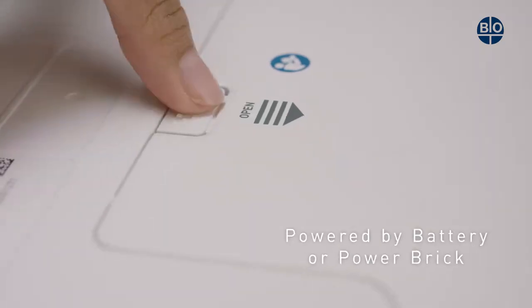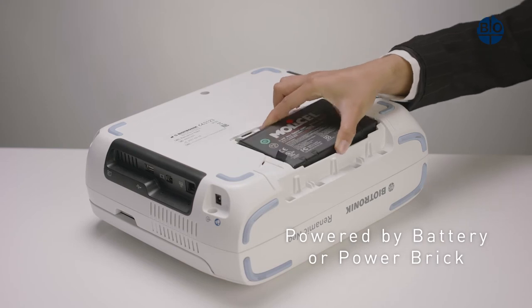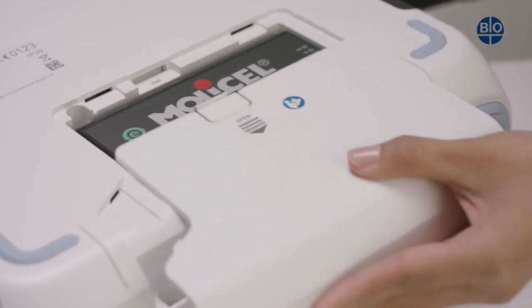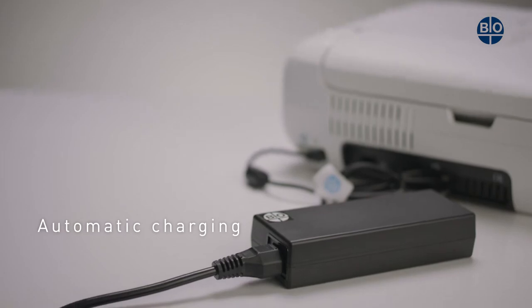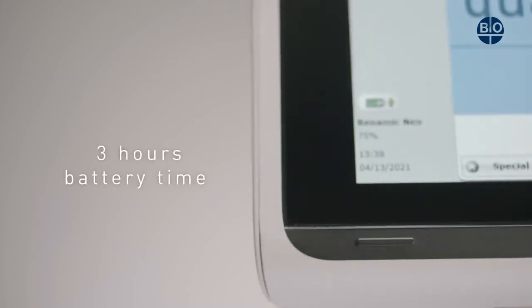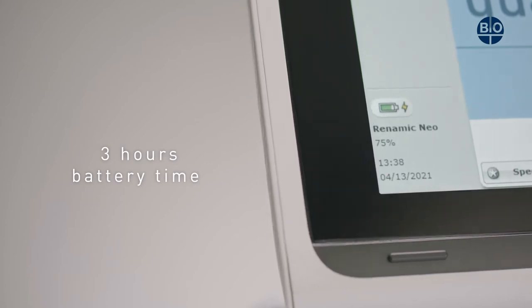The Renamic Neo can be operated with a battery or power brick. To insert the battery, first remove the battery cover, then insert the battery, and then close the cover. The battery will automatically charge whilst the device is connected to the power brick, and the device does not need to be switched on. A fully charged battery will give an operating time of up to three hours, making the Renamic Neo fully portable.